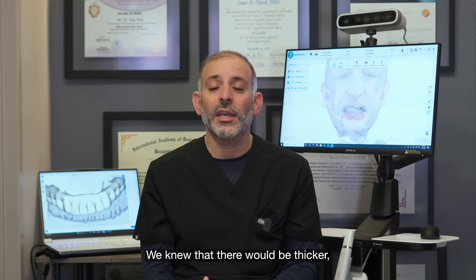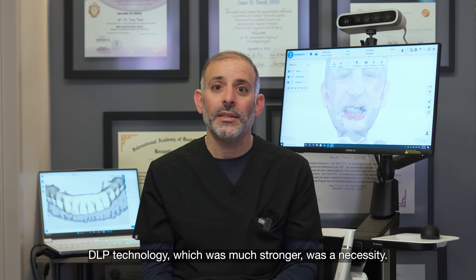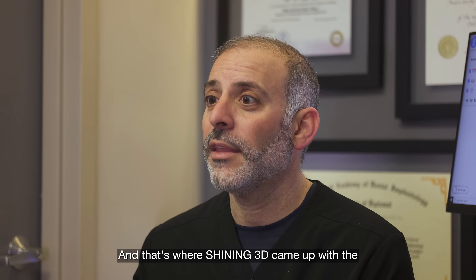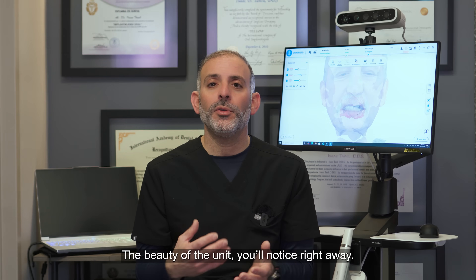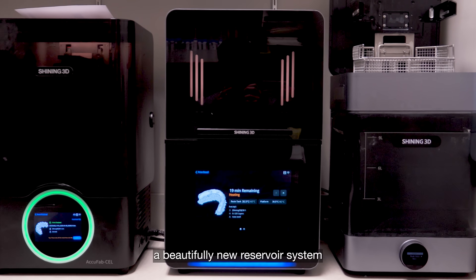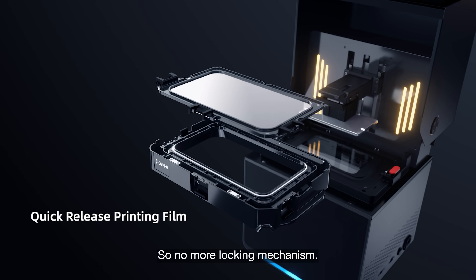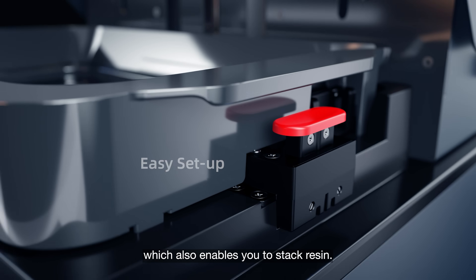We knew that there would be thicker, heavier materials coming out on the market. DLP technology, which was much stronger, was a necessity, and that's where Shining3D came up with the F1 printer. You'll notice right away we've also introduced a beautifully new reservoir system that has a click-in solution, so no more locking mechanism, making it very easy to install.